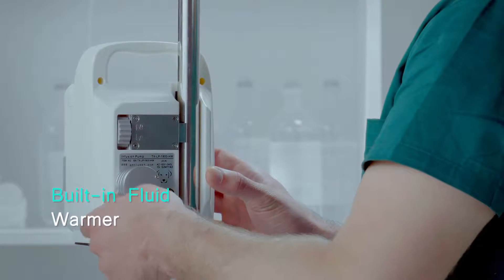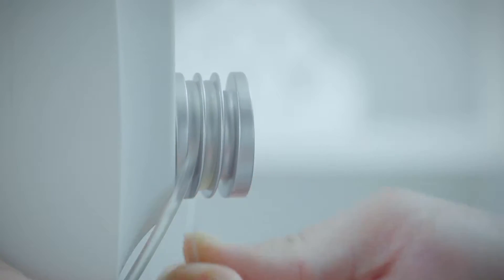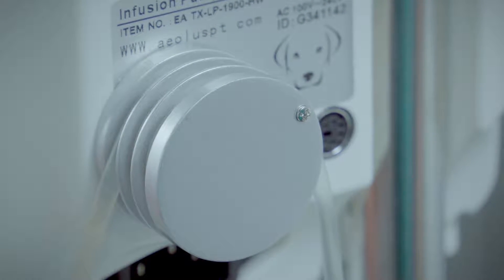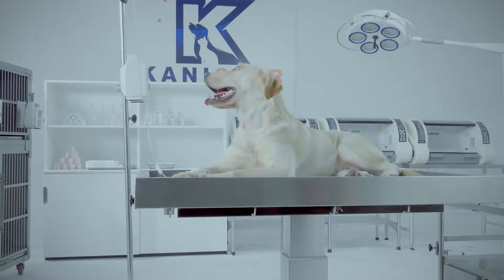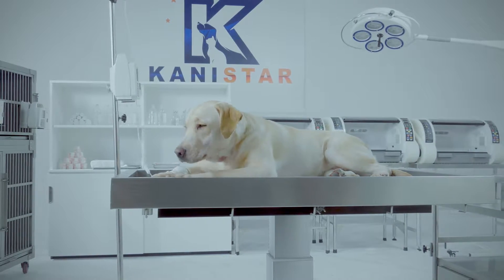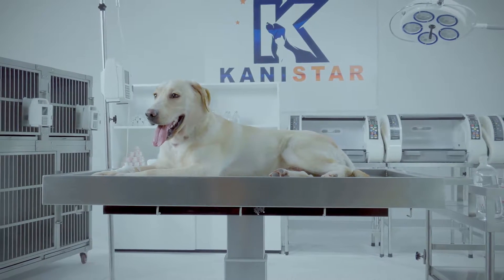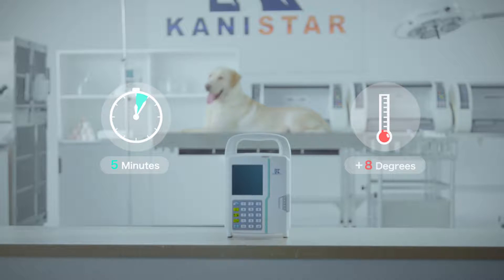Built-in Fluid Warmer. The rapid drop of core body temperature can cause shivering, wound infection, heart problems, and even lead to death. This warming module is the easiest way to prevent hypothermia in transfusion treatment — fast and easy to set up.